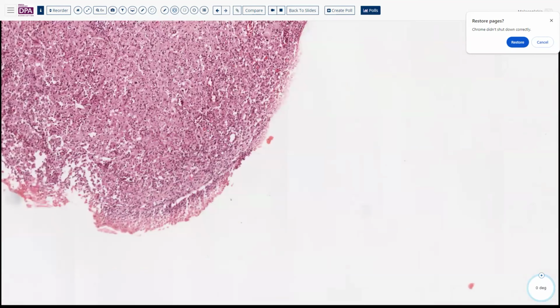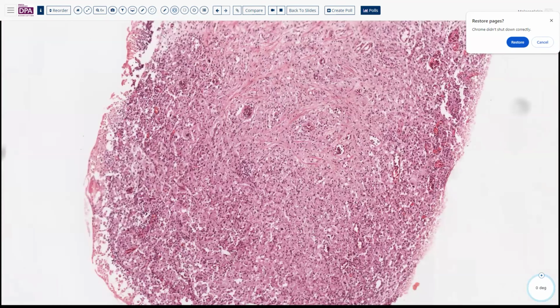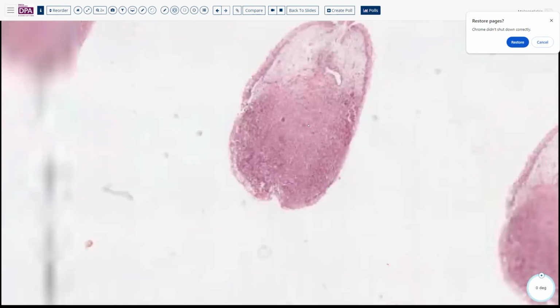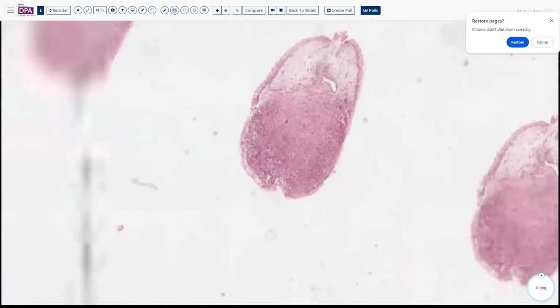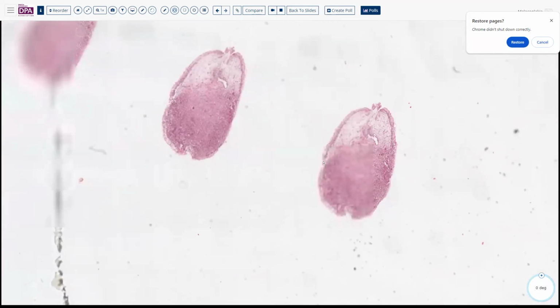And that's one of my favorite little diagnostic lesions. We don't just see it in the urogenital tract. We can see it in other locations. It can be seen rarely in the GI tract, occasionally in the GYN tract as well, but certainly most frequent in the urothelial tract, but also occasionally up in the upper GU tract in the kidney as well.